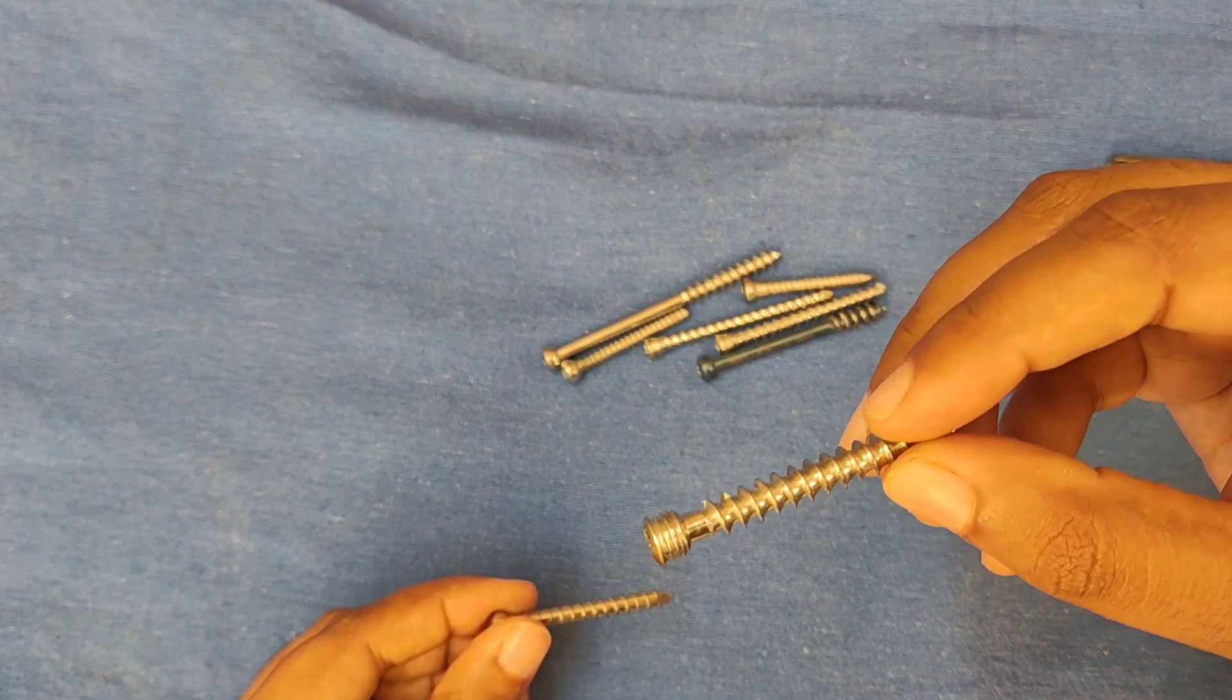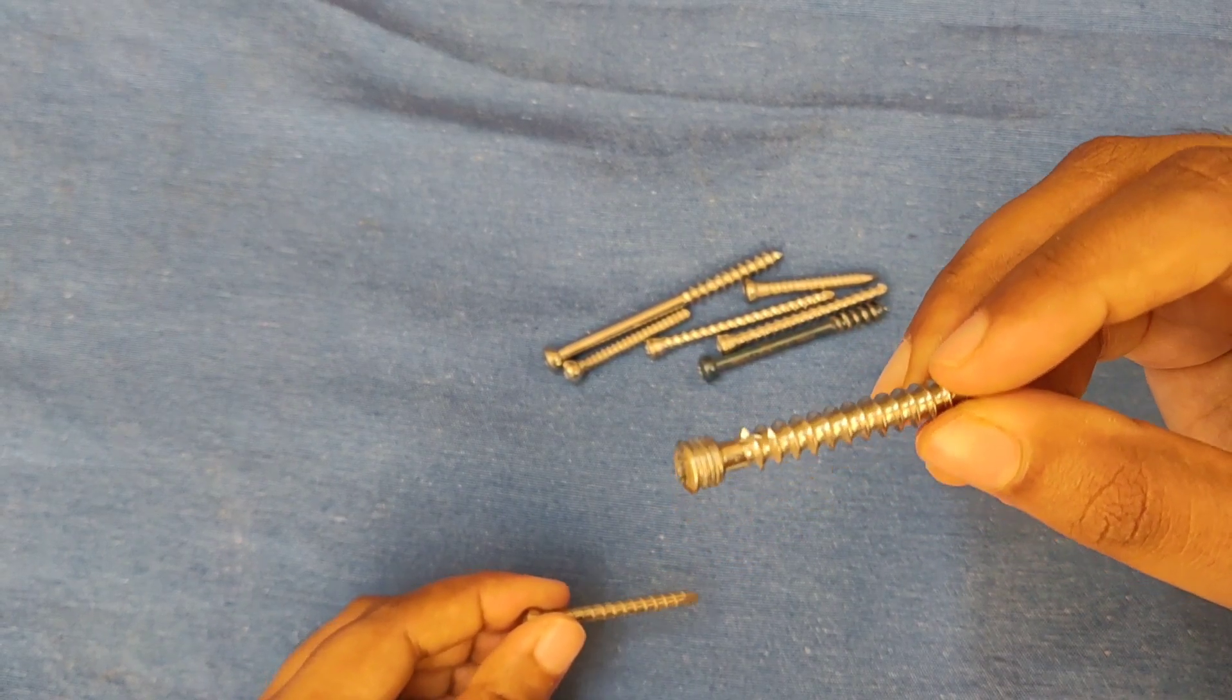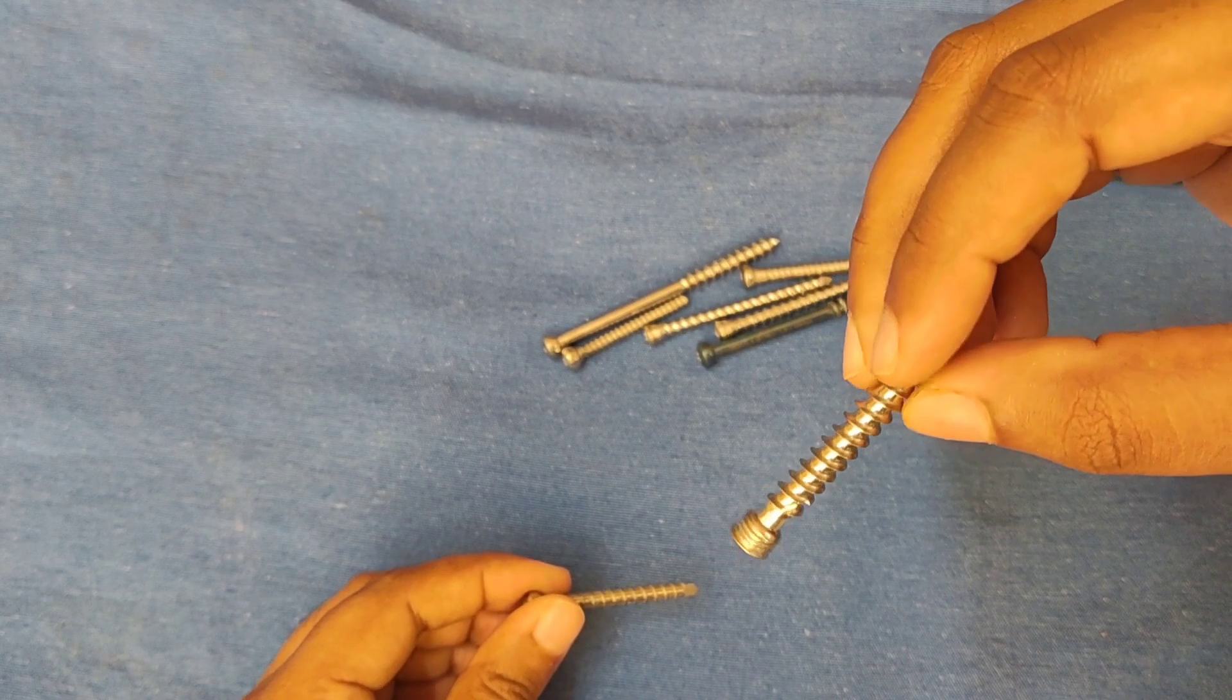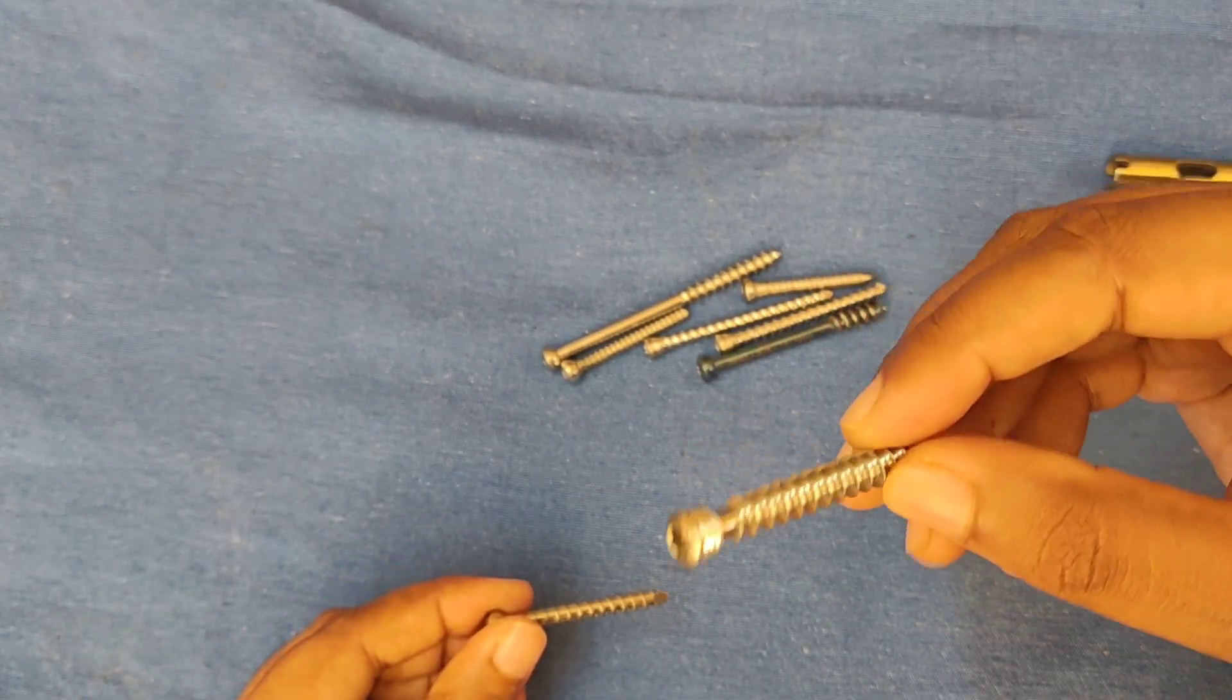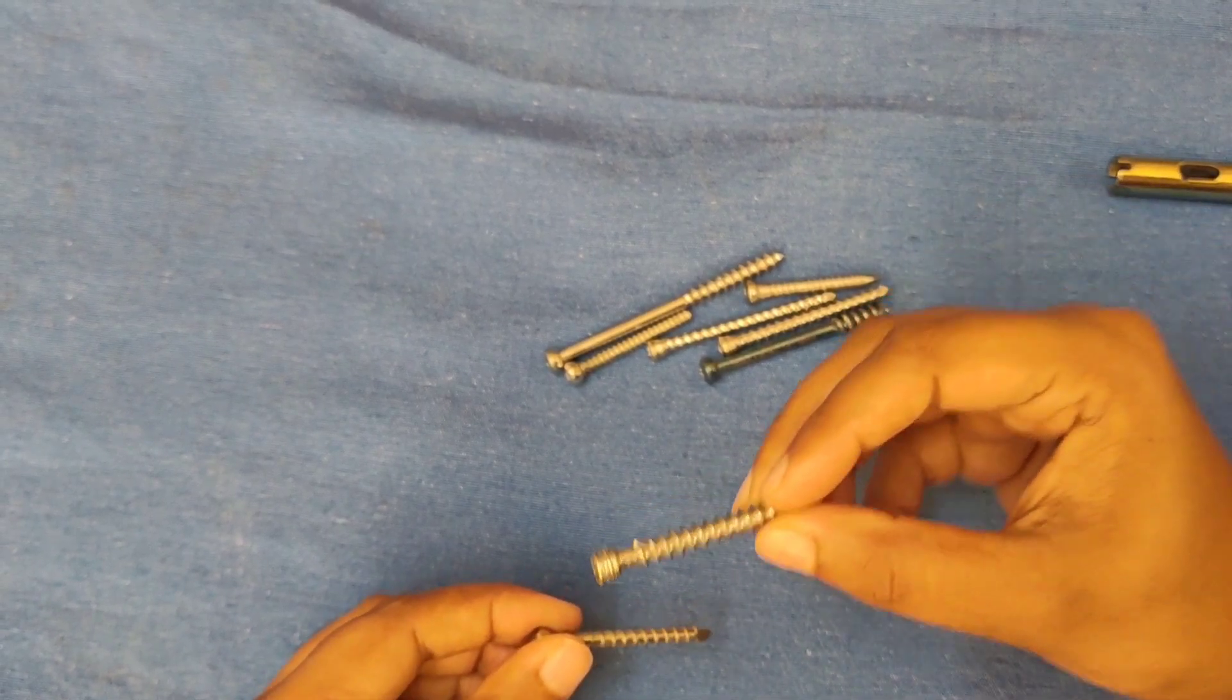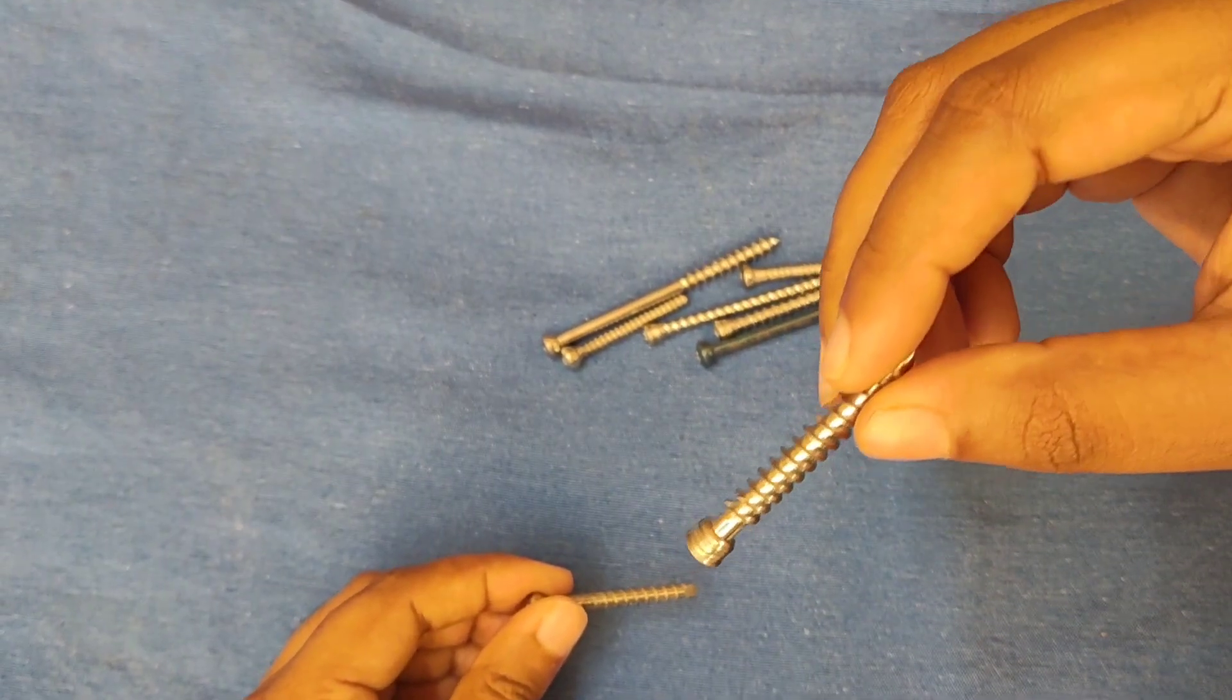Cortical screws are basically diaphyseal screws. They have less thread diameter, so the pull-out strength is very less. In case of good bone quality we can insert this screw safely. In case of osteoporotic bones and metaphyseal areas, we can use a cancellous screw where the thread diameter is more and it has good pull-out strength.